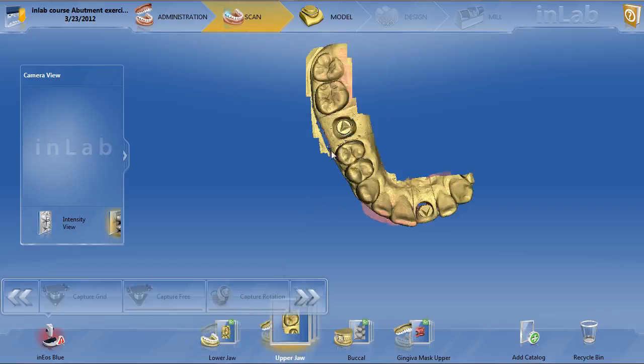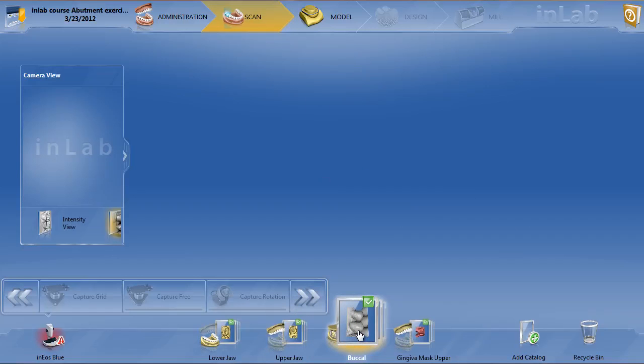And generally when I do the scan body, I like to do it personally in the mouth if at all possible. I go ahead and screw in the titanium base, then place the scan body over the top. If the implant's not placed too deeply, it's not that difficult to do. If it's deep, we'll obviously do it indirectly and take an implant level impression. So we'll obviously take a buccal bite to articulate those 2 jaws.